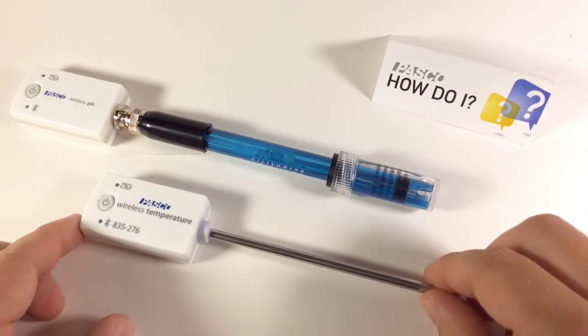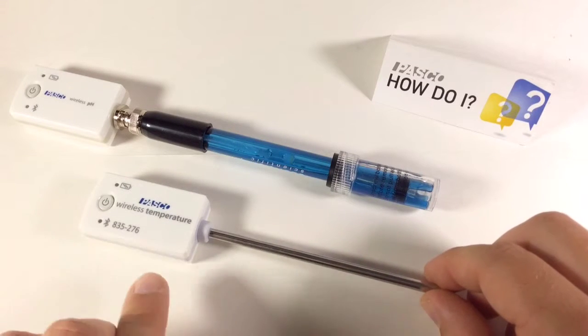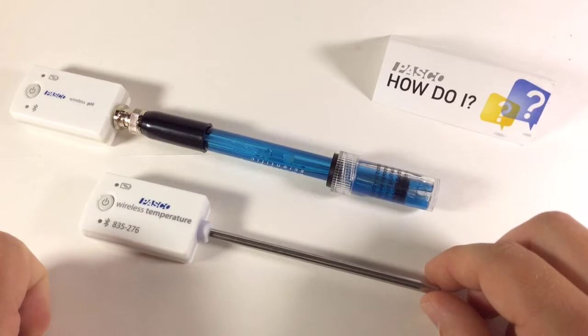How do I replace the battery of a PASCO wireless sensor that uses coin cell batteries, such as the wireless temperature and wireless pH sensors?